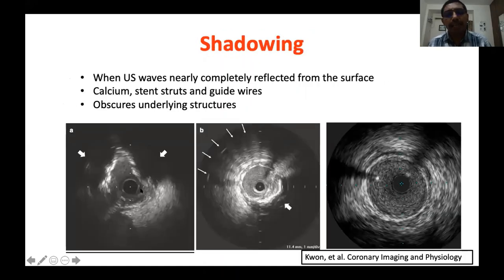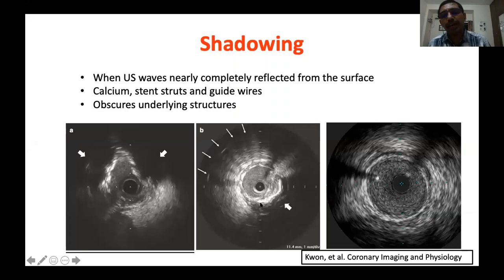Shadowing occurs when all ultrasound waves are reflected from the surface. This shadowing results from calcium, which intensely reflects ultrasound signals, causing shadowing of deeper structures. Other structures causing shadowing include air bubbles, stent struts, and guide wires — metal structures that reflect ultrasound from the surface. These are the common causes of shadowing in IVUS imaging.